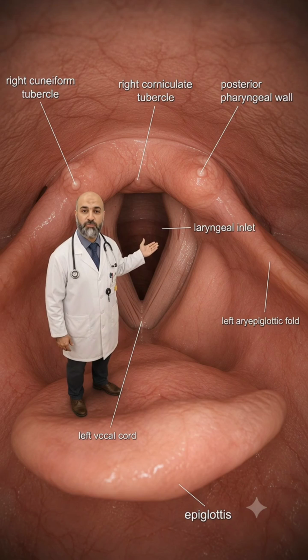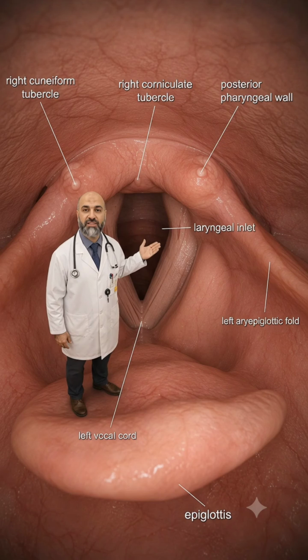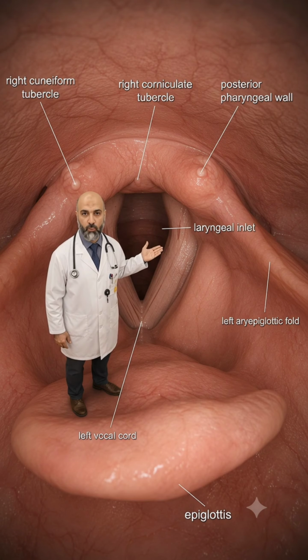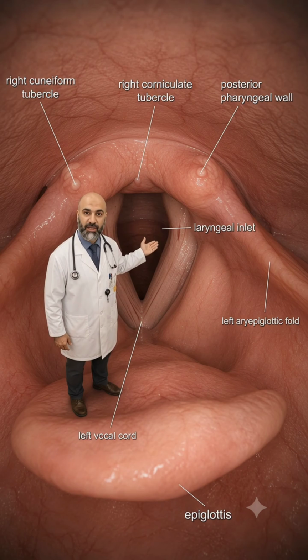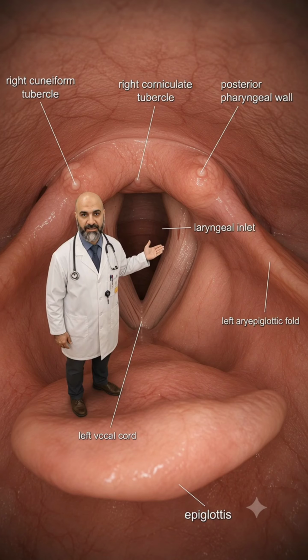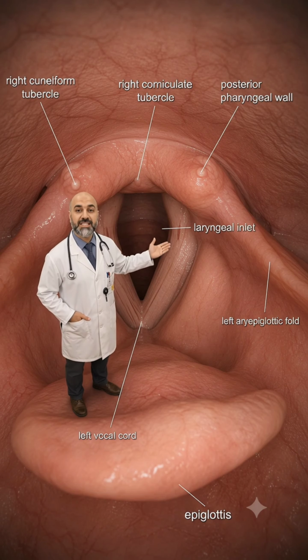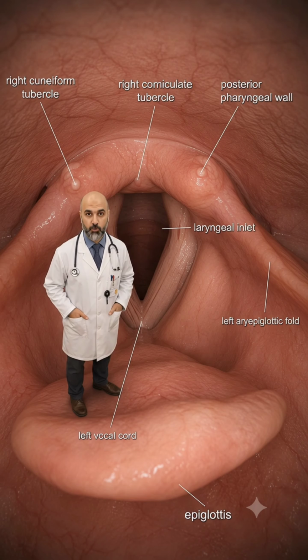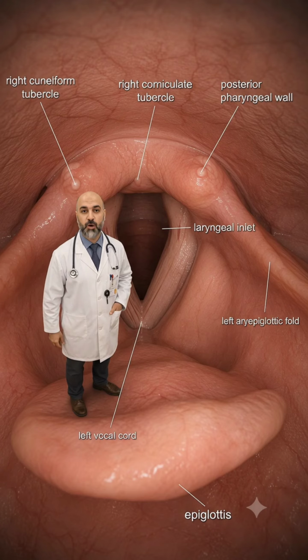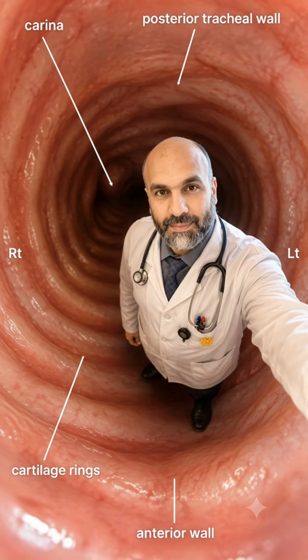As we advance the flexible bronchoscope, we can clearly identify the laryngeal inlet. The epiglottis is seen anteriorly, forming an important landmark before entering the glottic opening. Here we can appreciate the epiglottis and the aryepiglottic folds on both sides. Posteriorly, the corniculate and cuneiform tubercles can also be identified. And finally, we can see the vocal cords forming the glottic opening. The cords are the key landmark before we pass the bronchoscope into the trachea.